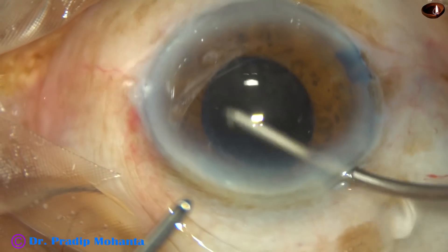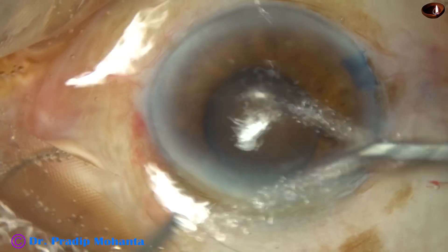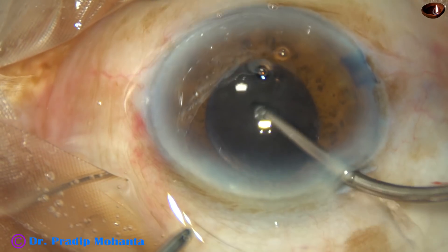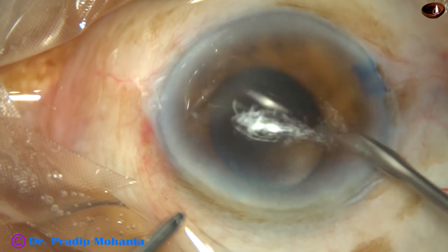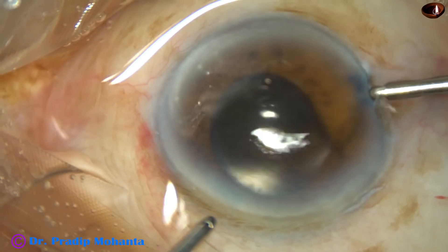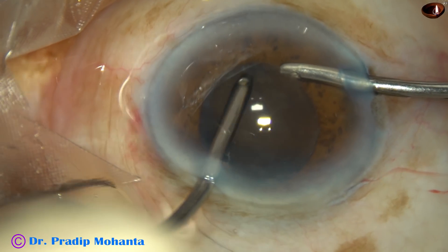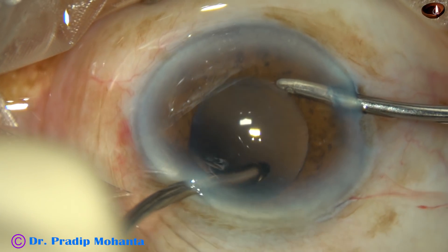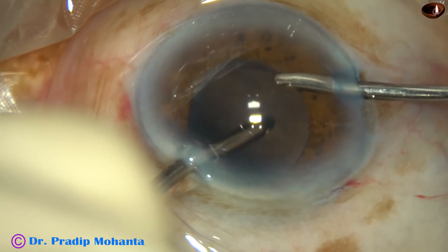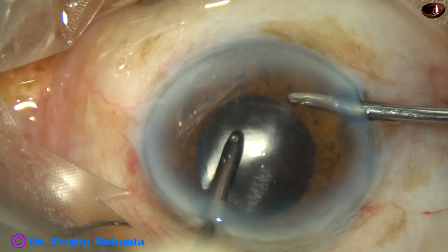The lens is in the bag. The optic is nicely covered by the anterior capsular rim all around, because the capsulorhexis was not very large. Now all the viscoelastic substance used for implantation of the intraocular lens is being removed by bimanual irrigation aspiration.